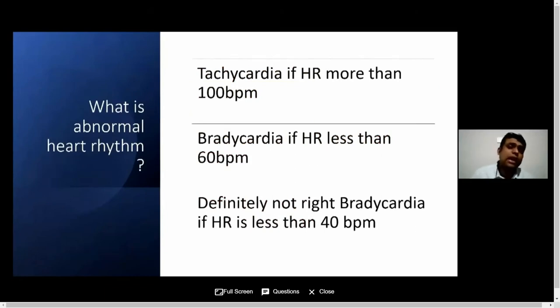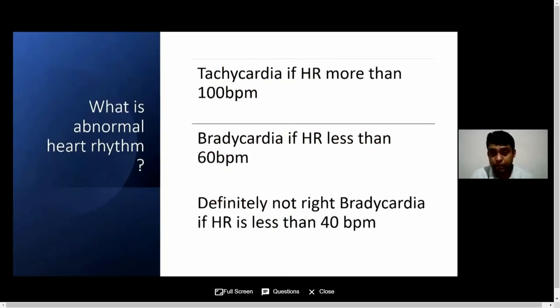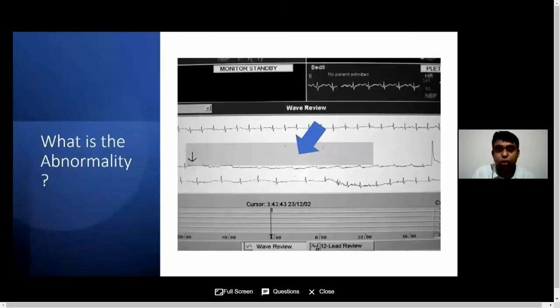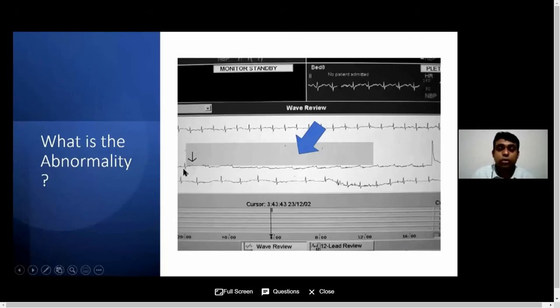So what is classified as an abnormal rhythm? If a patient has a heart rate of more than 100, that is abnormal — do you need an explanation for that? If a patient has a heart rate less than 60, then again it is abnormal. And definitely if a patient has a heart rate of less than 40, that is extremely abnormal. Look at this abnormality on the monitor — you can see the first row with nicely coupled P waves and QRS complexes. But then there's no QRS complexes, only P waves. The patient has developed complete heart block and gone into ventricular standstill. If you don't do anything about this patient, that patient will die.